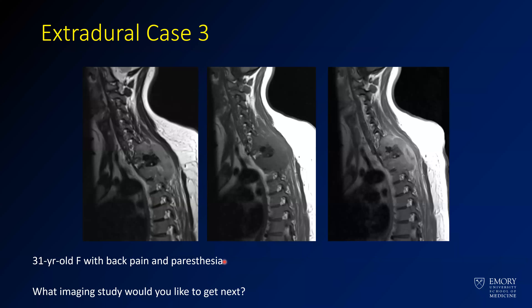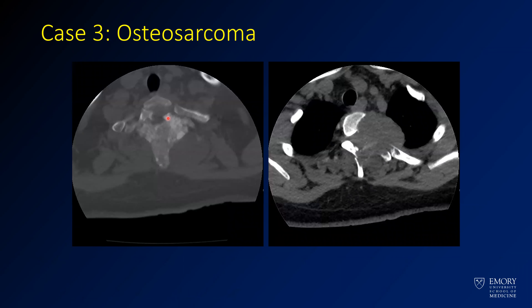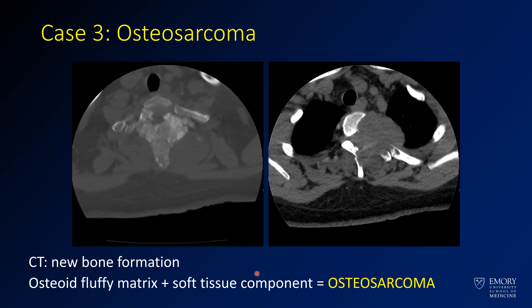Here is our third extradural case — a 31-year-old with back pain and paresthesias. There's a big expansile lesion off to the side, maybe coming from or involving the neural foramen, with low signal material in the middle that's dark on T2, T1, and post-contrast. Think about what you'd want next — you want a CT. This was a case of osteosarcoma, with a lot of new bone formation and soft tissue components. With this new bone formation, think about a bone-forming tumor. This is more of an osteoid-appearing matrix, without the rings and arcs you'd see with chondroid matrix. If you can tell someone you think this is a bone tumor, that's often enough to get to the biopsy.